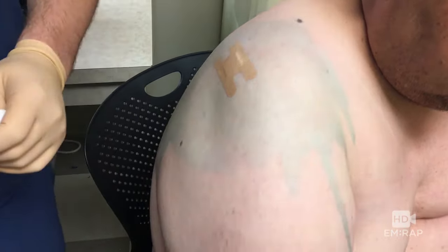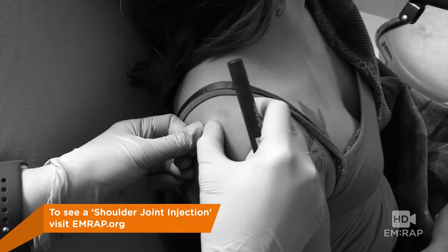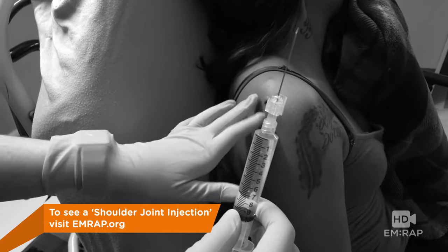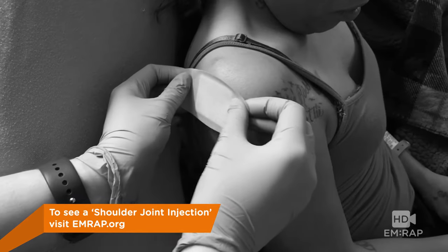For this patient, his range of motion improved almost immediately. Remember, this technique looks very similar to an arthrocentesis of the shoulder or an intra-articular shoulder injection, so be sure to check out that video as well and make sure you found the one that suits your needs.